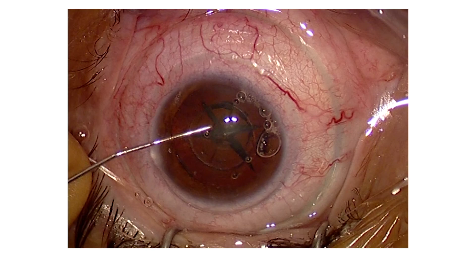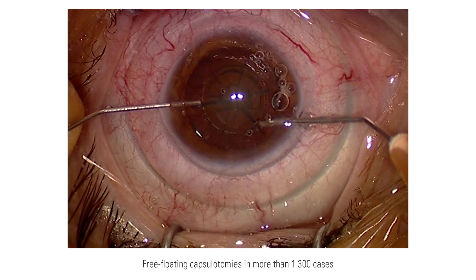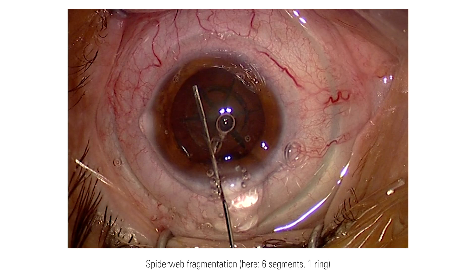The cystotome is used to double-check the integrity of the capsulotomy. However, in over 1300 cases, I have always experienced a free-floating capsulotomy. In this case, I used a spider web pattern with six segments and one ring.